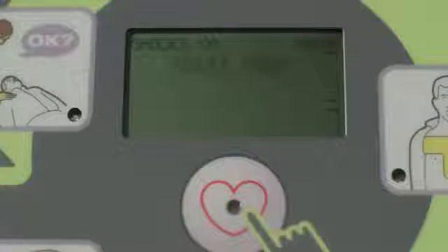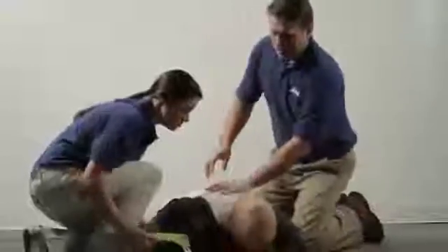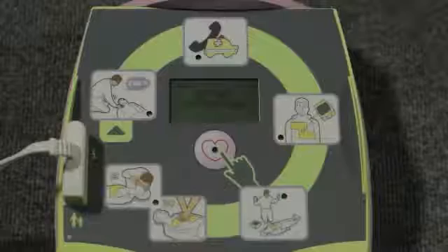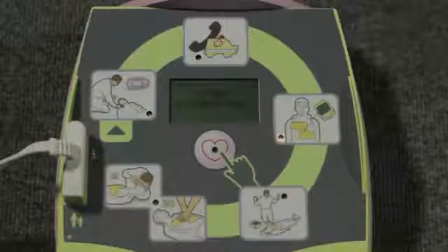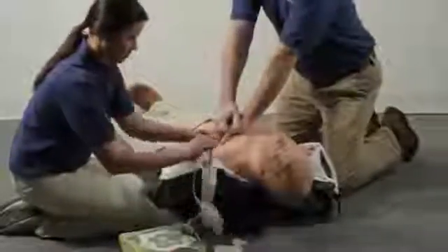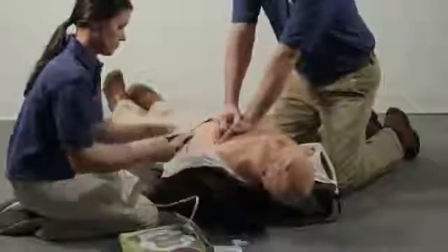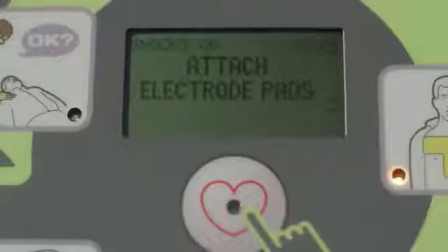Unit OK. Adult pad. Stay calm. Check responsiveness. Call for help. Proceed immediately to attach the electrode pads to the victim's bare chest. Attach defib pads to patient's bare chest.